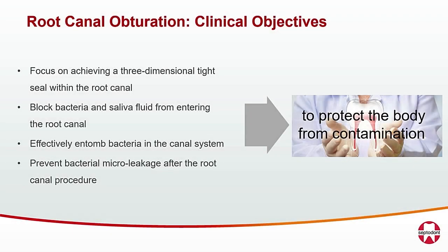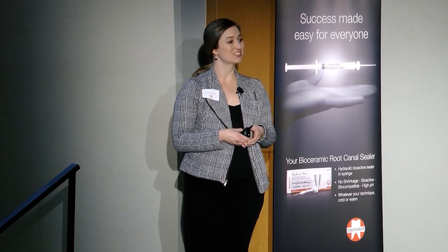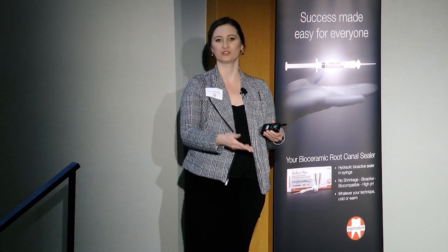So going back to basics, what are we trying to accomplish with obturation? Obviously, we're trying to create a seal that is going to be impermeable. I actually had one of my assistants who was supposed to be handing me calcium hydroxide hand me sealer. She had extruded some into a tip and put it onto the calcium hydroxide and didn't tell me. I thought I was placing calcium hydroxide in a canal, and I was very interested when the patient came back for their second appointment to find out that there was something rock solid in the canal, and it was white, but the patient was feeling better. I was able to essentially retreat my own case and then finish the final obturation.